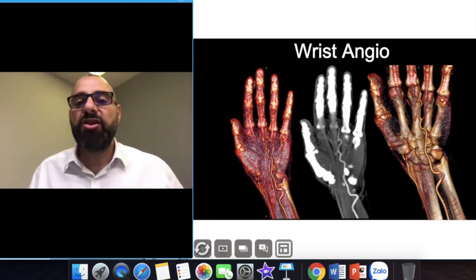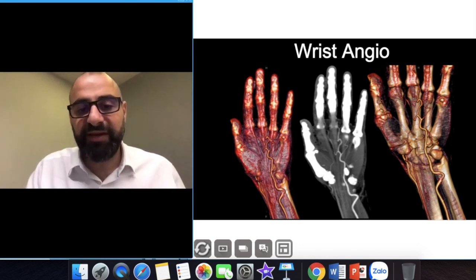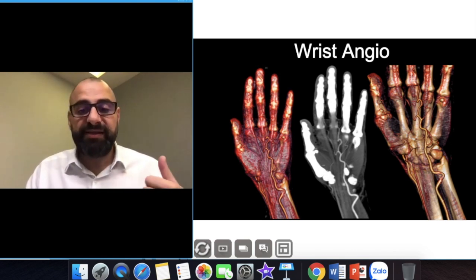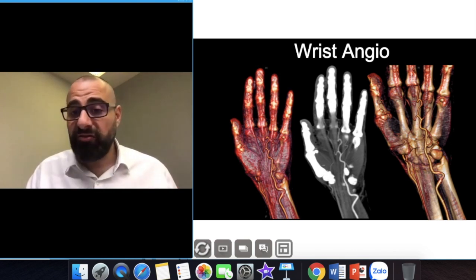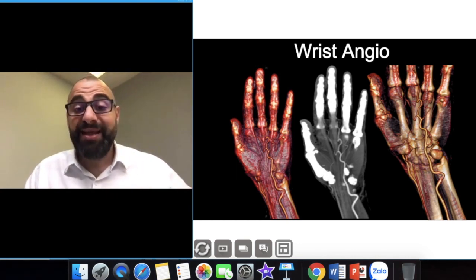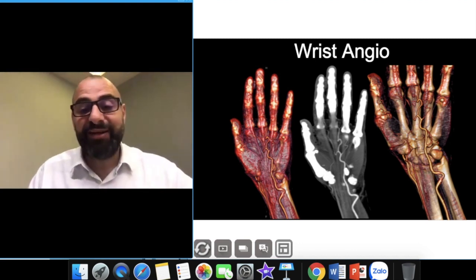This is a wrist angiogram. Remember we need to wait long enough at the level of the elbow to see how the contrast is filling. This was a diabetic patient — the ulnar and radial arteries were really good but the digital arteries were poorly enhanced. This patient had vasculitis — this is exactly what it looks like.